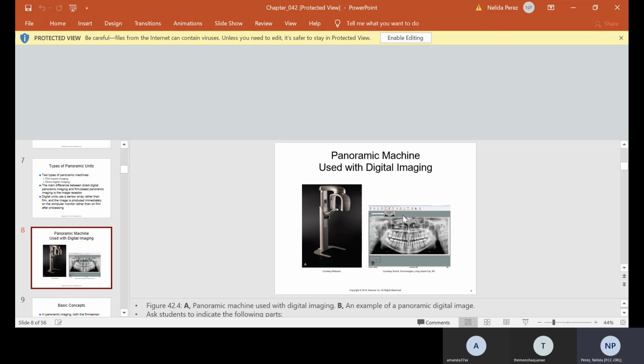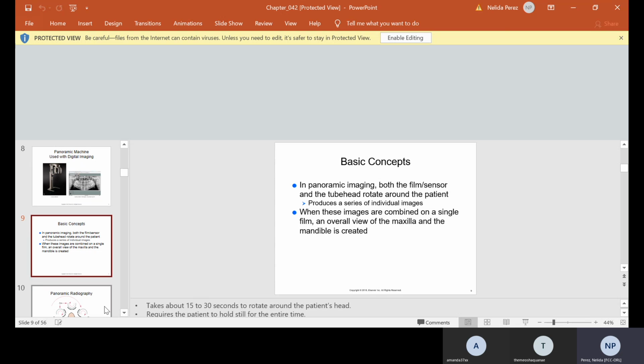And then in this panel, if you look real closely, this person has braces on, and that's what you're seeing. Also, they have their 4 wisdom teeth coming in. More than likely, they will be taken out. They're still in the bud stage, so the doctor is probably waiting a little bit until they come out more. And then up here, you have the sinuses on the maxillary. So again, take a real good look at that x-ray on figure 42.4.